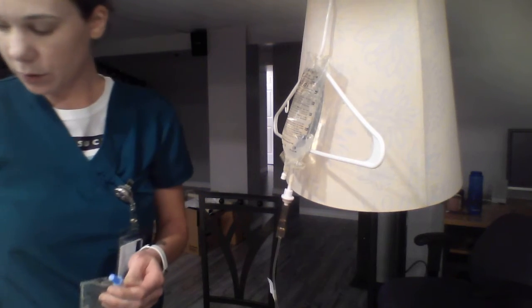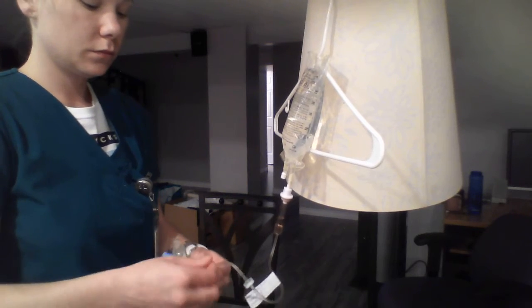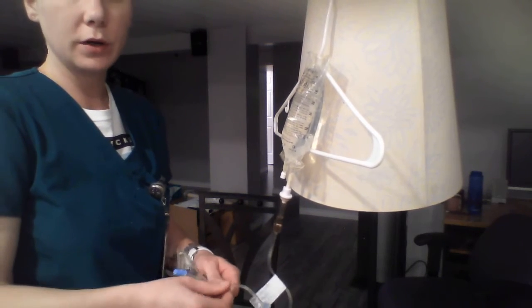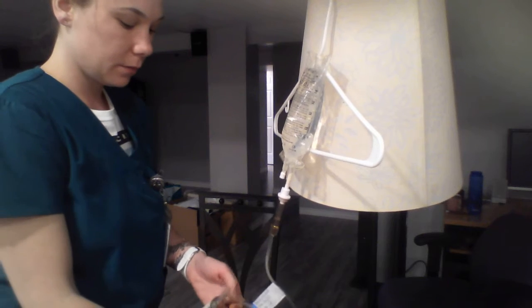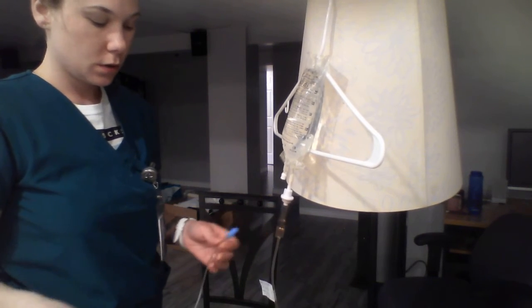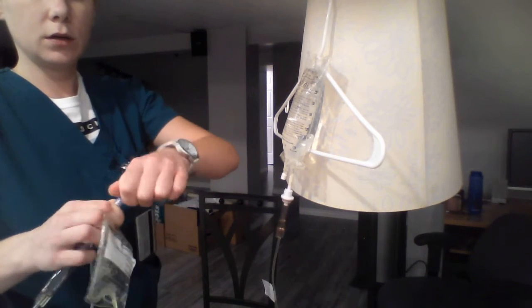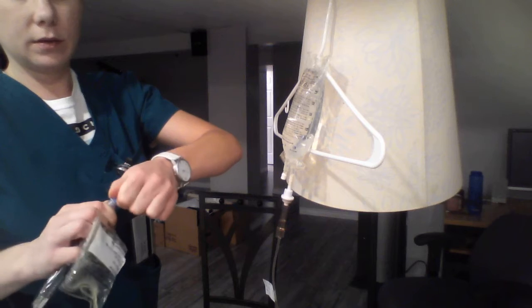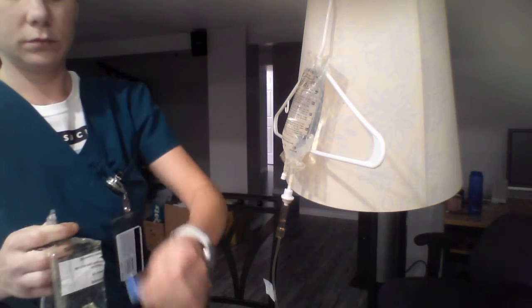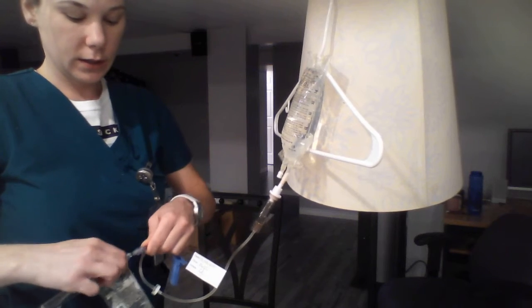I'm going to swab the port vigorously with my alcohol swab, trying to maintain sterile asepsis. So I'm going to open my mini bag, and I'm going to attach the piggyback.